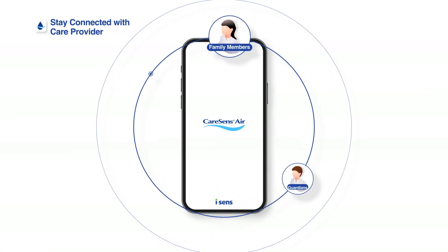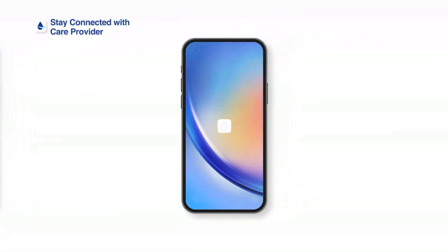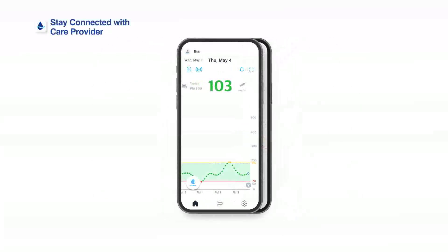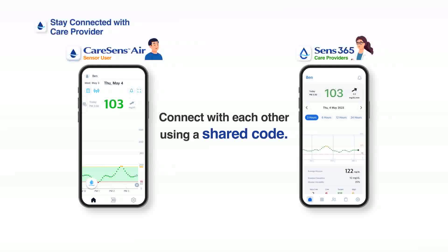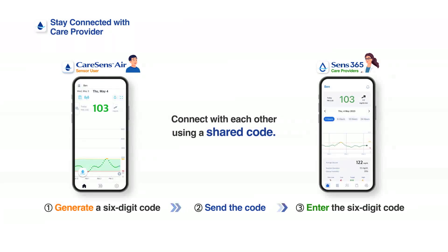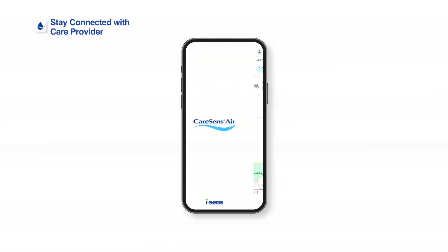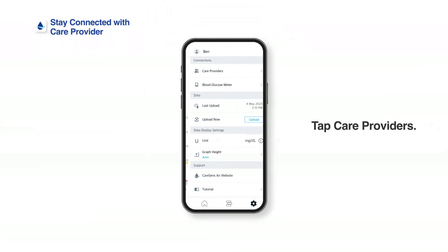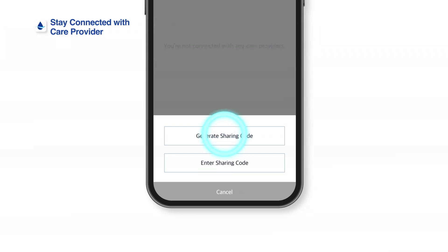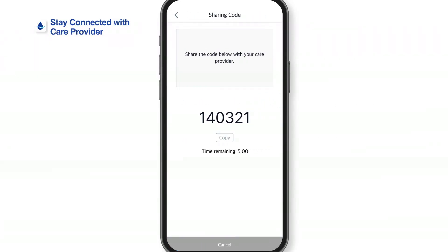The Kerasens Air app allows users to share their glucose data with family members, guardians, or health care providers. Care providers can install the Sense 365 app on their smart devices to receive and monitor the user's glucose data. To share glucose data with a care provider, the Kerasens Air app user must generate a code first. Tap Settings at the bottom of the home screen, then tap Care Providers. Tap Connect to link your account to your care provider, then tap Generate Code. Choose the data you want to share and deliver the generated code to your care provider.